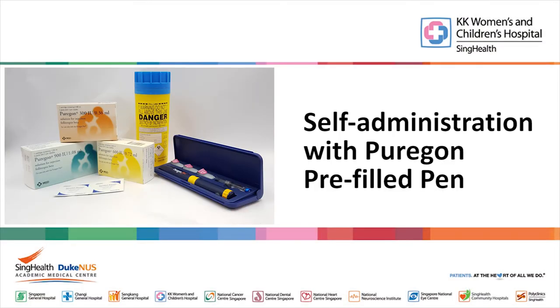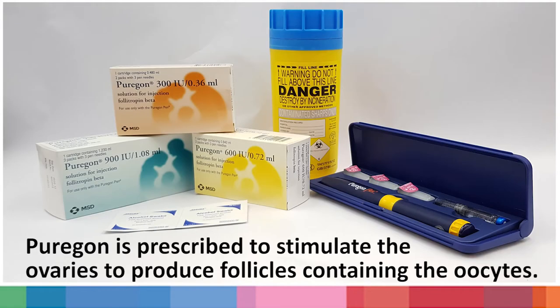The following video will show you how to inject subcutaneous Pyoregon at home. Pyoregon is prescribed to stimulate the ovaries to produce follicles containing the oocytes.